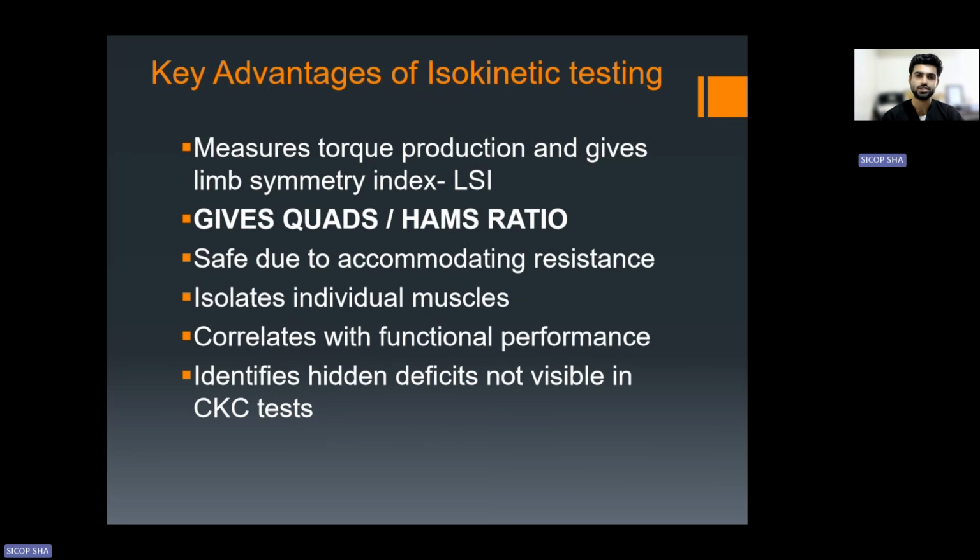Some athletes or patients come to us after 3 to 6 months. They say, I'm okay, my thighs are very good, my muscles are very strong, just by looking visually. But when we test isokinetically or isometrically the quadriceps muscle, we can give a real-time measurement of the torque production. We can directly tell that your quadriceps is still 25% reduced compared to your unaffected leg, and you are not ready to return to sports. So there are multiple criteria for return to sports based on testing with the isokinetic machine.